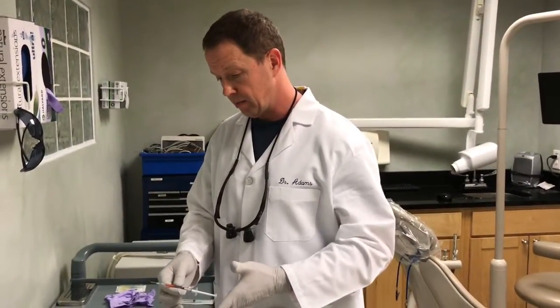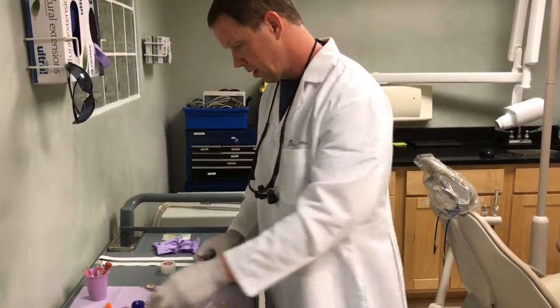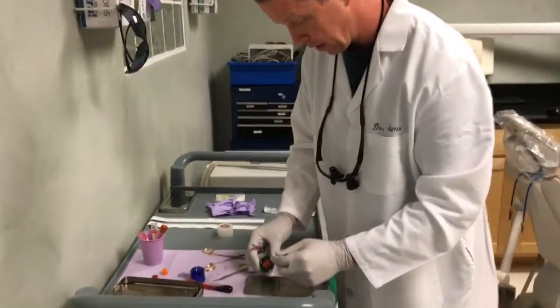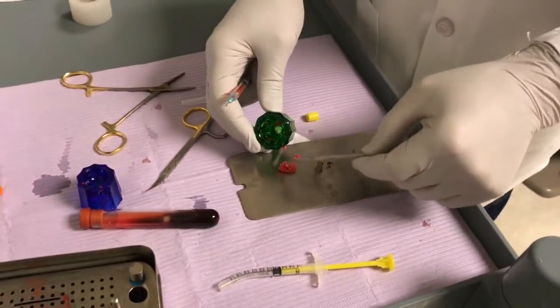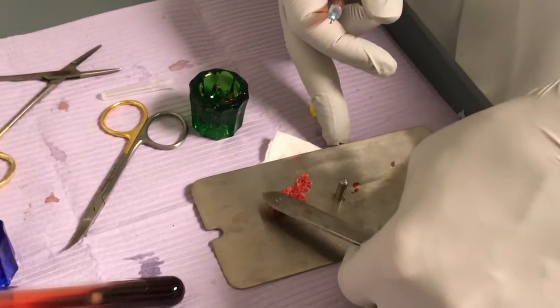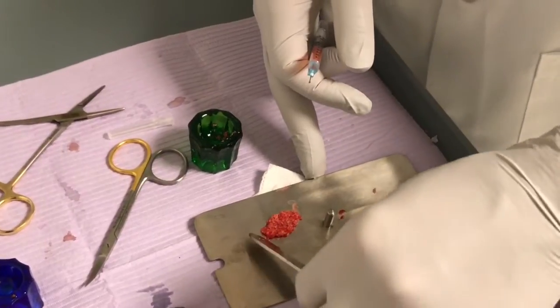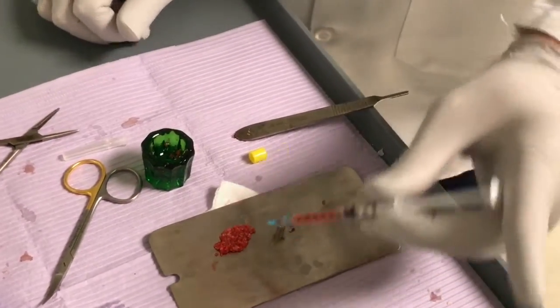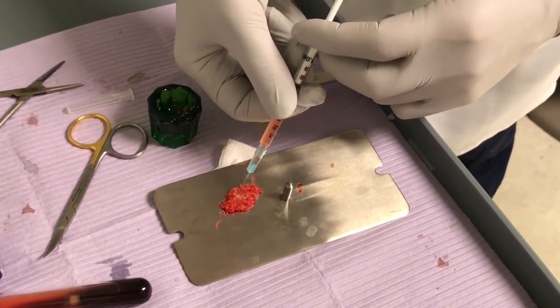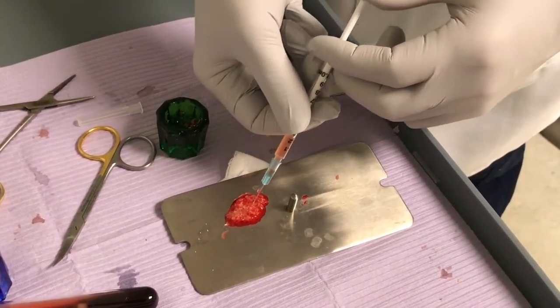Some physicians will inject this into people's knees if they have joint issues. But what we're going to do is use it to form a nice bone graft product that we can easily deliver to the patient's mouth. I'm going to mush this down. Blood products do clot — we've got clotting factors in here, and we're going to take advantage of that. I'm going to put a few drops of this platelet treatment here, and in about three minutes this is really going to clot nicely.